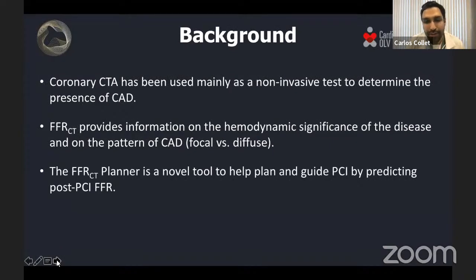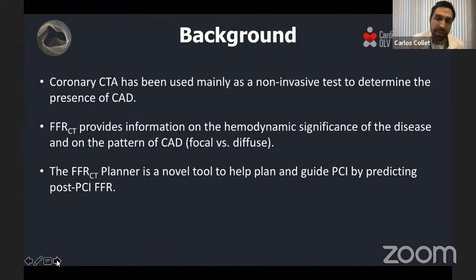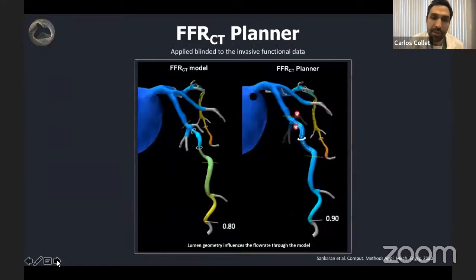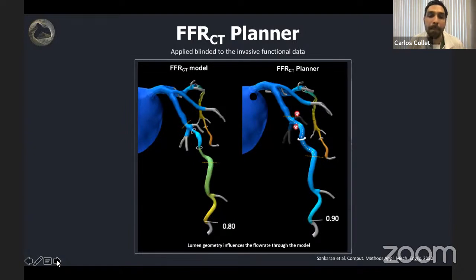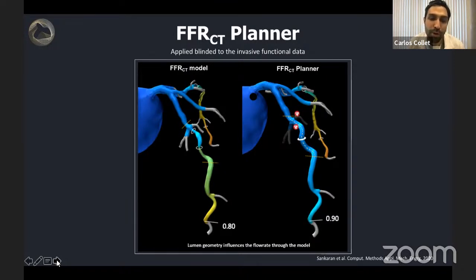FFR CT has this potential to help us understand not just lesion significance, but also the appropriateness of PCI. We have a novel tool called the FFR CT Planner, which is an integral component of CT-guided PCI. This tool mimics PCI and tries to predict post-PCI FFR. But it's not only about the prediction of FFR — it goes beyond that.